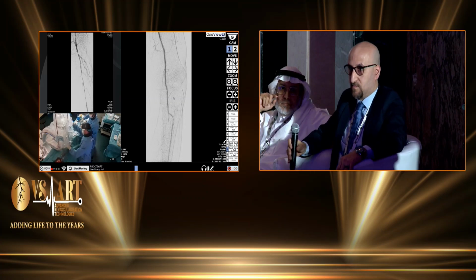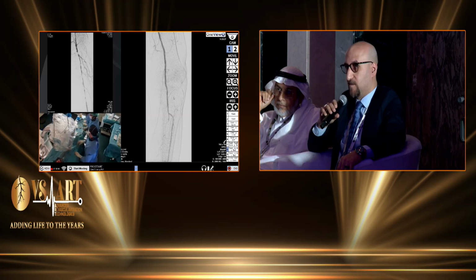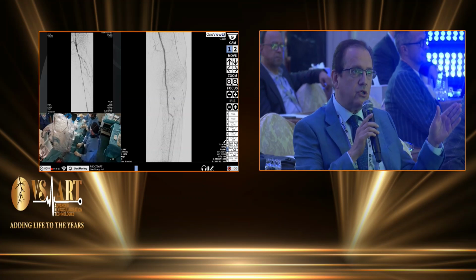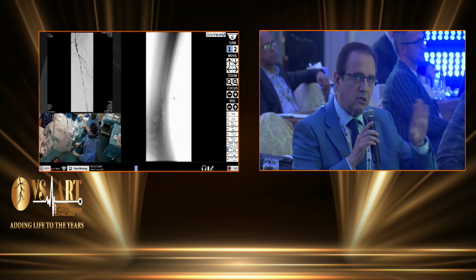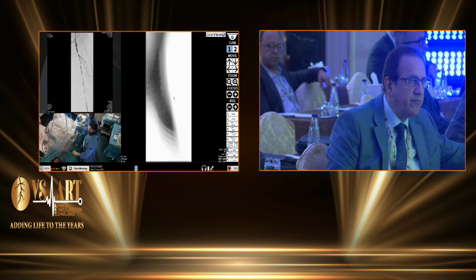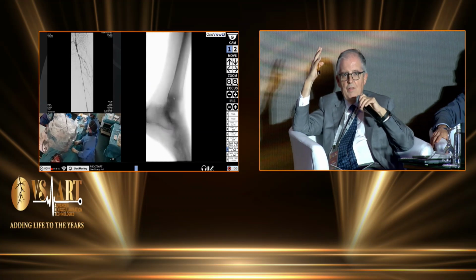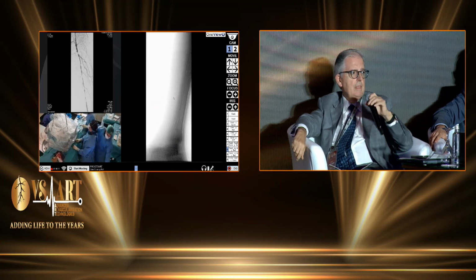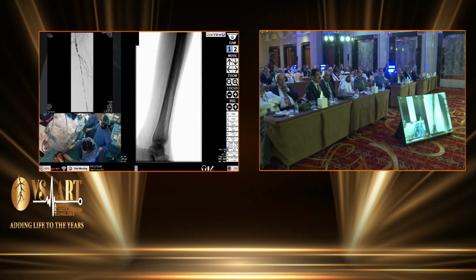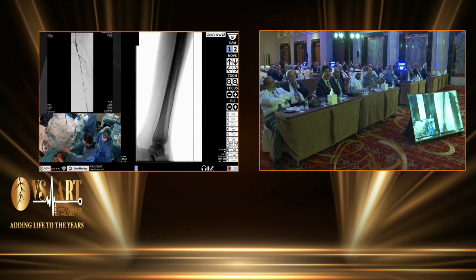Can I say something? If we get to the point where we have to sacrifice one of them, I think we have to go open, because I think it's not acceptable to sacrifice any of them. So if we get to the point of having to choose to sacrifice one of them, I think we should stop endo and do an open repair. So it's important to preserve the profunda always. Yeah, that is the first scenario. And the second, talk about, yeah. Always profunda. The second question here is, if we have to stent this area.